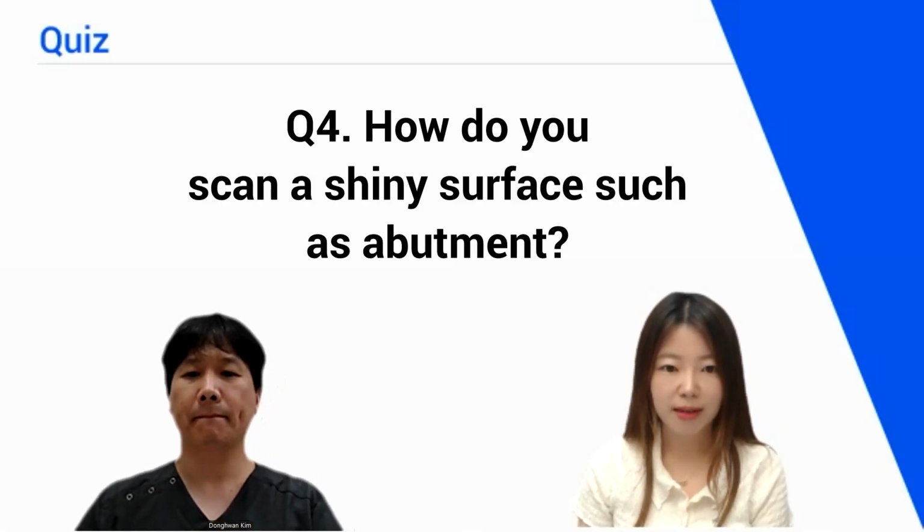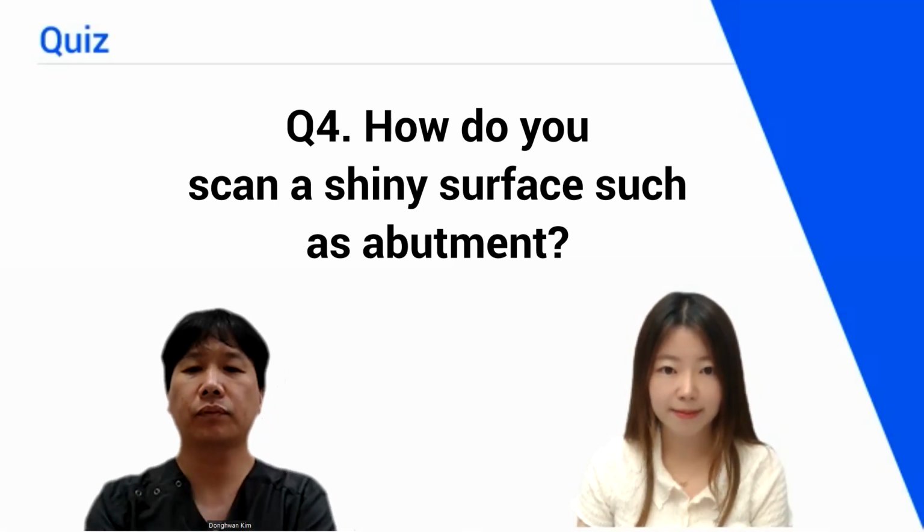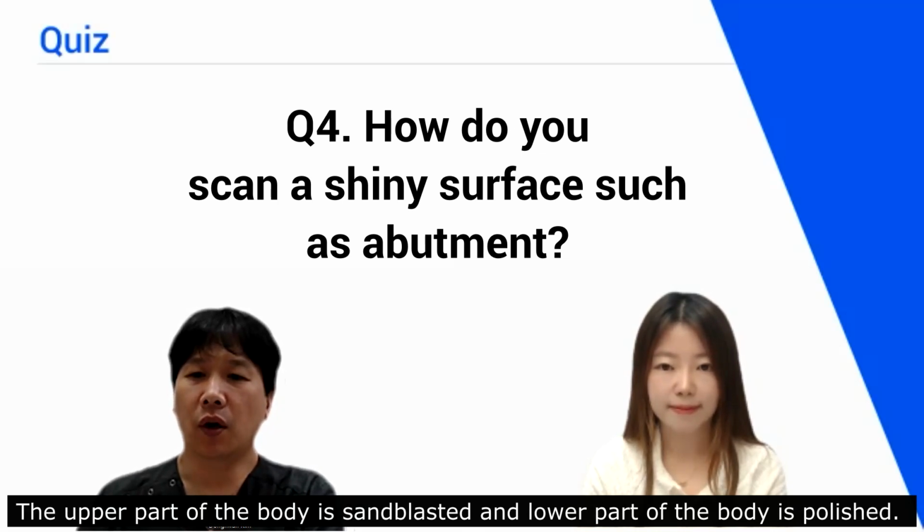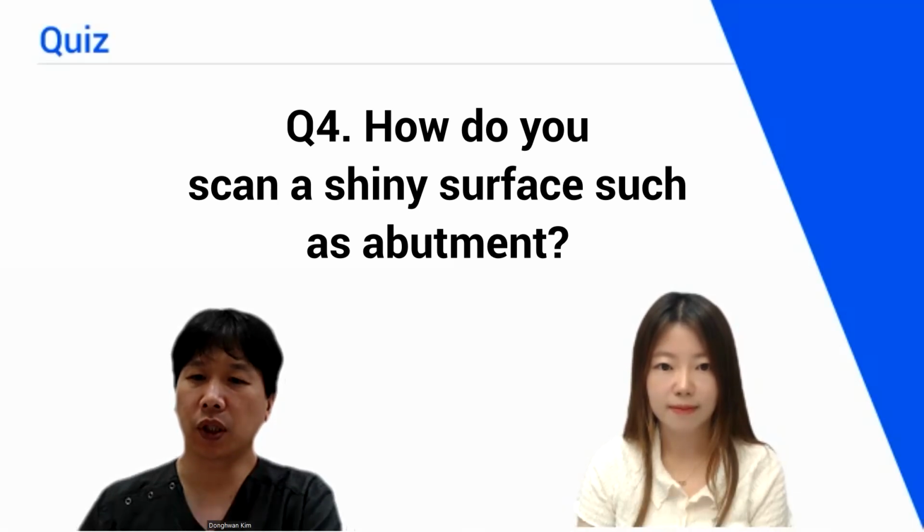I see. Question number 4. How do you scan the shiny surface, such as abutment? I make the abutment ready with surface treated. The upper part of the body is sandblasted and the lower part of the body is polished.